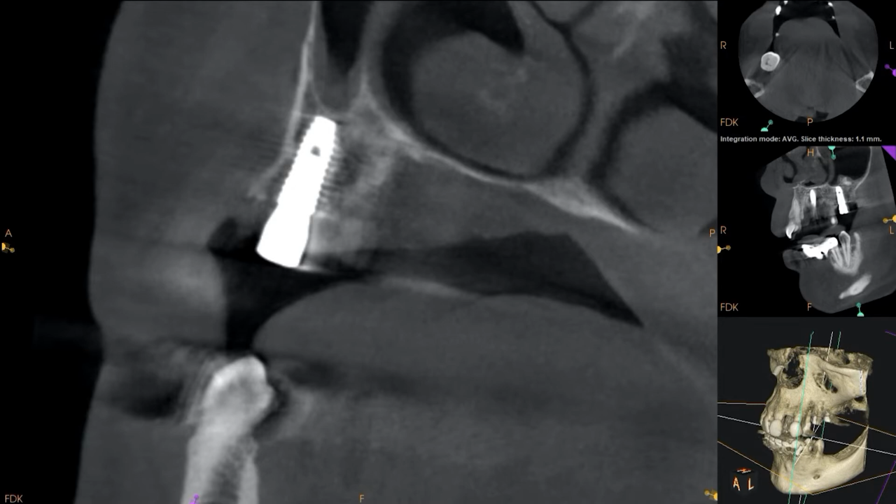Another thing I would highlight, if you look at the trajectory, it's pointing right at the clinical crown of the lower dentition. So we know as far as force management, this appears to be in a really nice ideal position. Obviously that's not the most accurate way of measuring that, but it's always comforting when you see the crown down below and you know the implant's headed right at it. That's a great sign that this is going to be a good, thoughtful restoration with respect to force management.